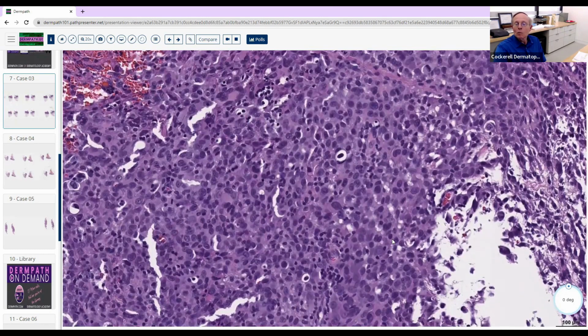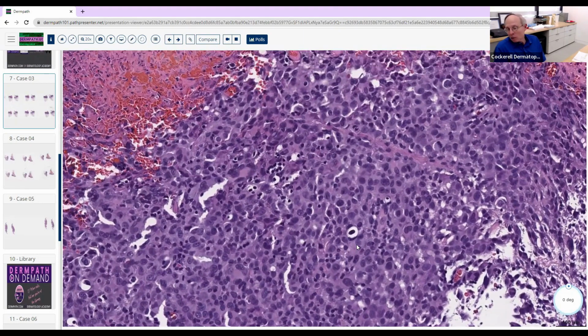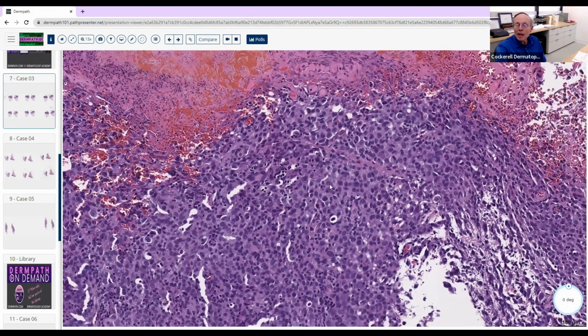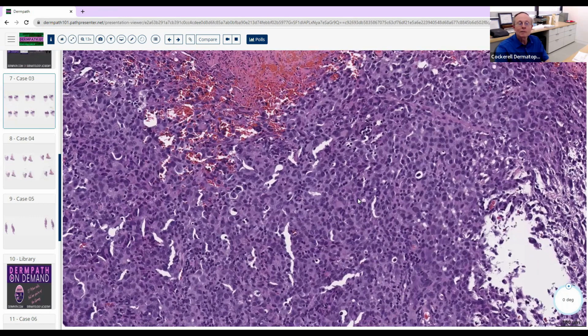So I'm thinking this is the old game of read my mind. Are you aware of any kind of tumor, neoplasm, that can look like a granulomatous dermatitis? That's an important entity not to miss. It can look like granuloma annulare histologically, and it's seen often in young individuals. It's one of the most common causes of sarcomas in young people on the acral parts of their body, on their arms and whatnot. You may not remember that. It's not totally obscure, but it's something I definitely want you to file away in your mind, to always think about it, at least briefly.